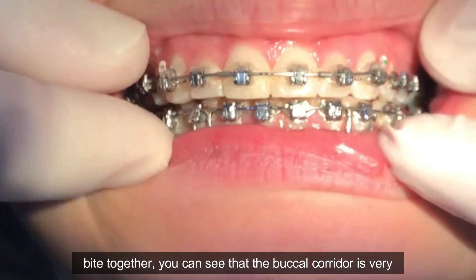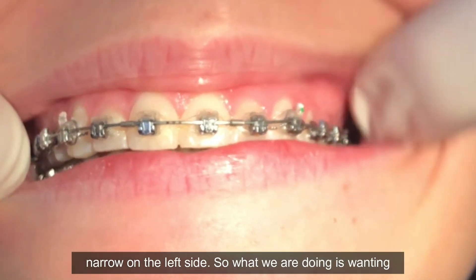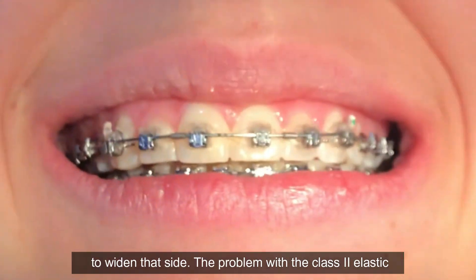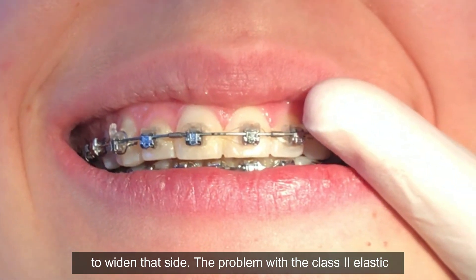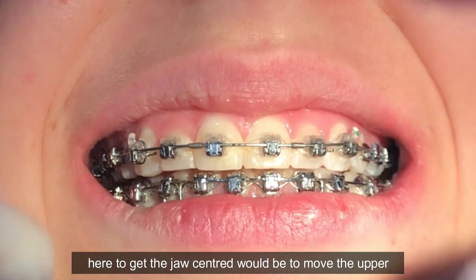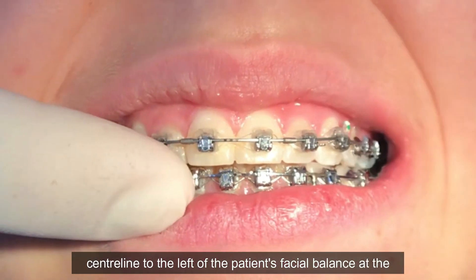If you look at the smile line here, biting together, you can see that the buccal corridor is very narrow on the left side. So what we're doing is wanting to widen that side. The problem with a Class II elastic is it's going to compress that side.